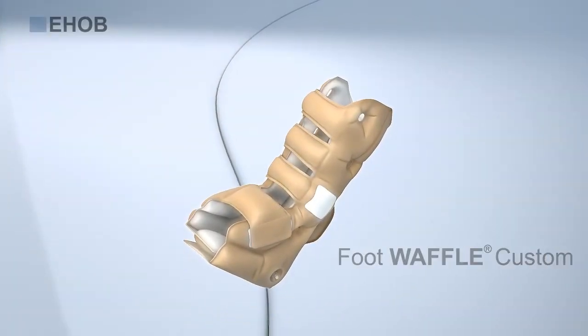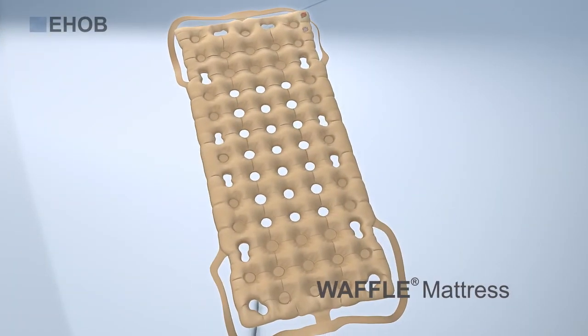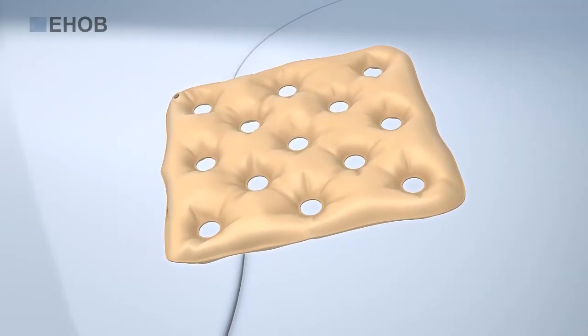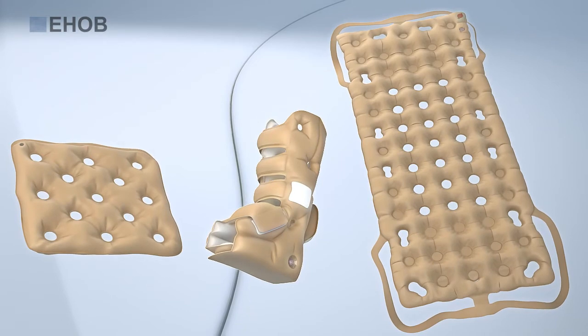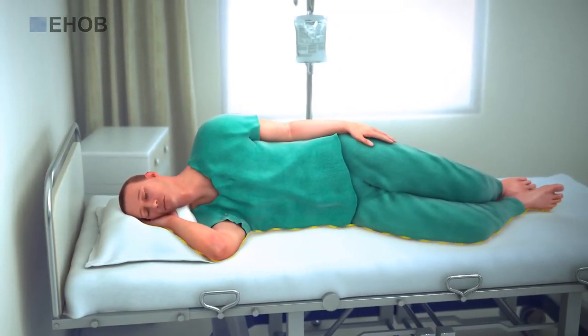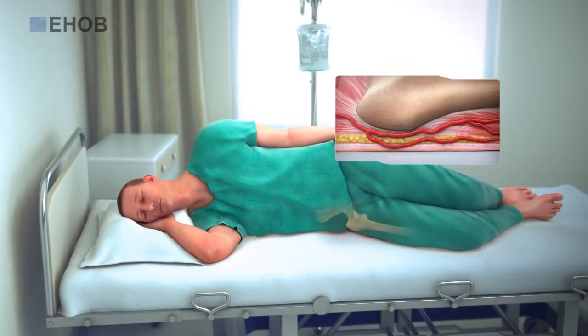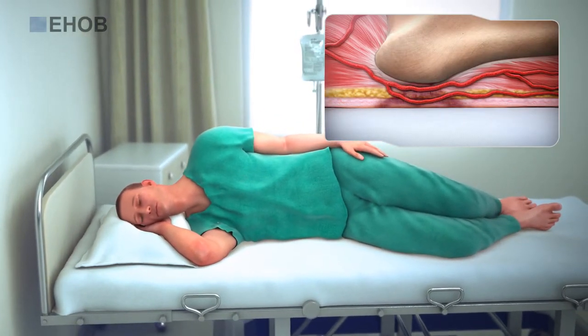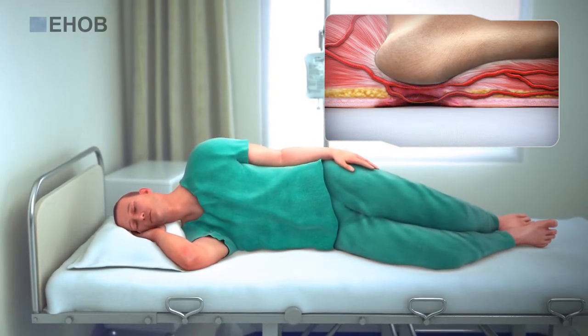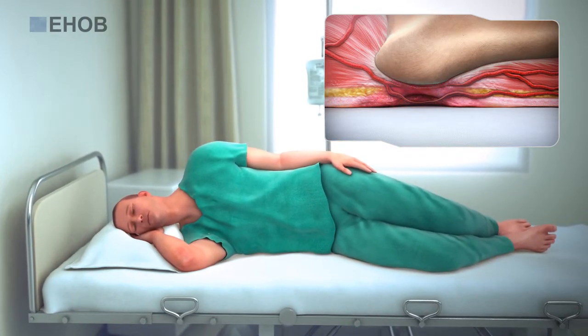Why static air? Because hundreds of years of scientific theories, laws, and principles have proven that flotation therapy works. When a patient lies or sits on a solid or foam surface, the soft tissue trapped between the surface and the bony prominence becomes distorted from the mechanical stresses that are created by unequal pressure and shearing forces.